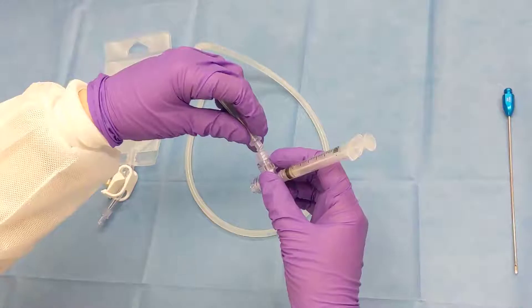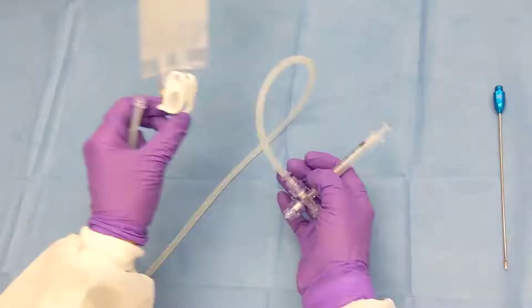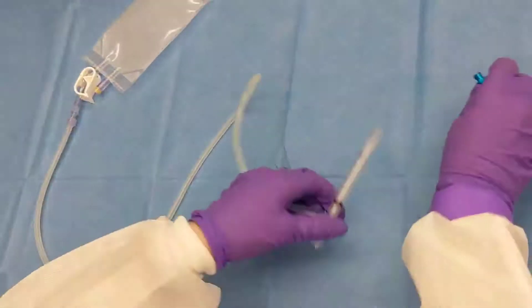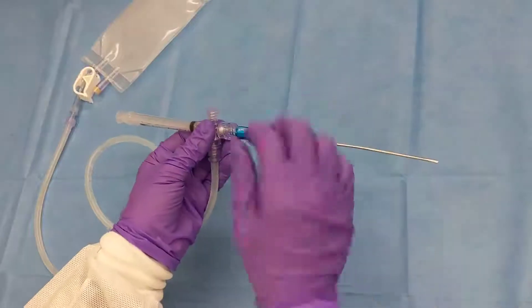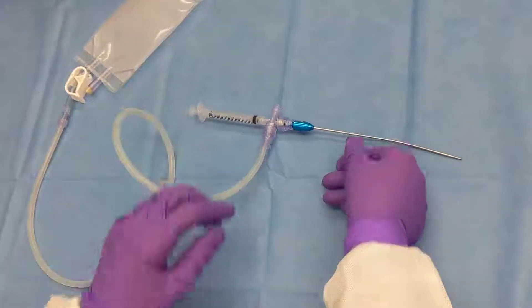You'll then take the tubing and connect it to the male port and the storage bag to the tubing. Then you'll take your grafting cannula and connect it to the AT valve, ready for grafting mode.